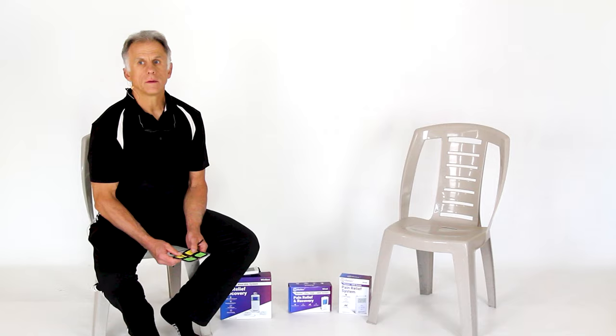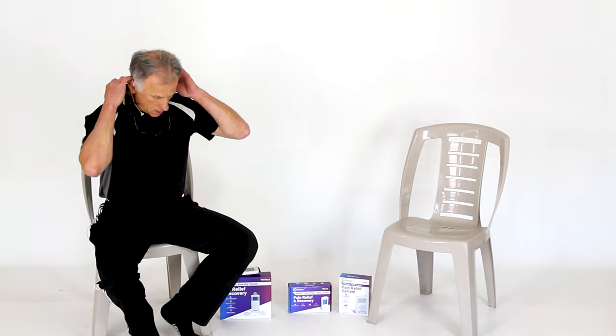We're going to show how to put pads on one-sided on the back of the neck, and then also two-sided. Mike, part of our camera crew and the Bob and Brad crew, is going to come up as our model. You won't hear Mike because Mike doesn't have a mic on.